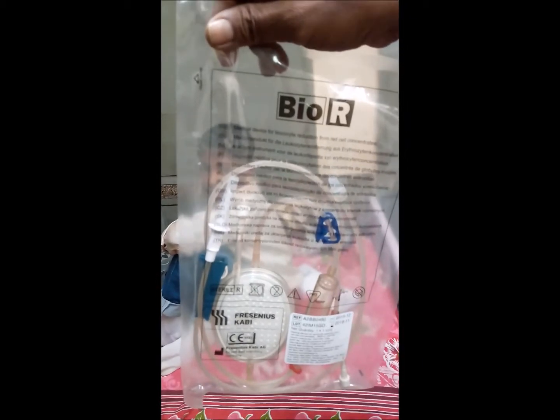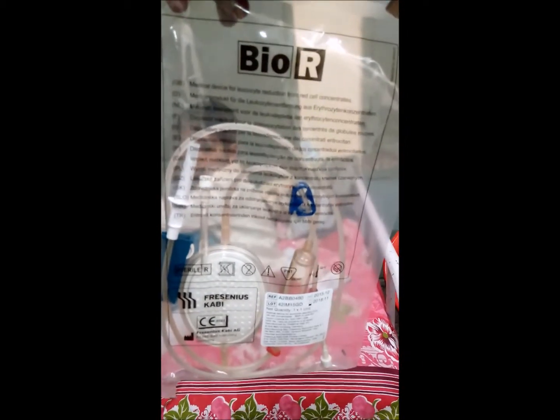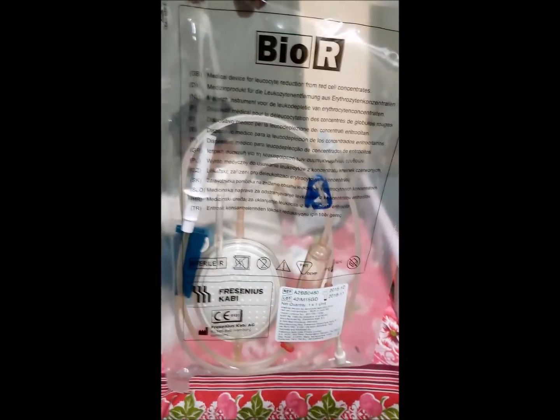Hello, I am Dr. Sangeeta, and this is a demonstration of the use of a leukocyte reduction filter at our Varanasi Region Thalassemia Welfare Society.